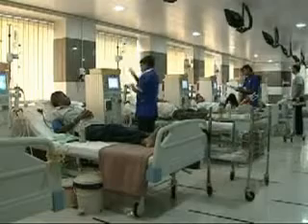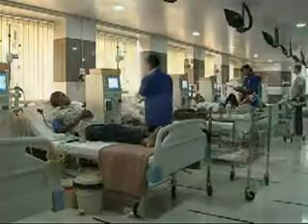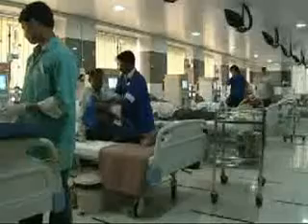This process takes 4 hours. After dialysis, the blood pressure will be checked. After checking the patient's blood pressure, the patient sits in the waiting area for 10 to 15 minutes so that the body can adapt. After that, the patient will go home.